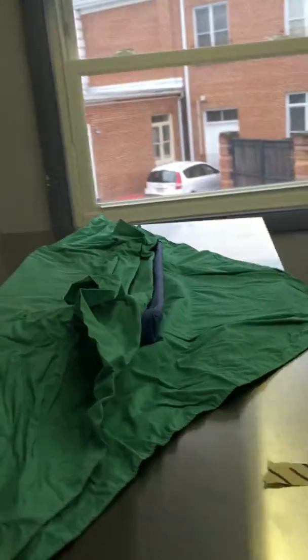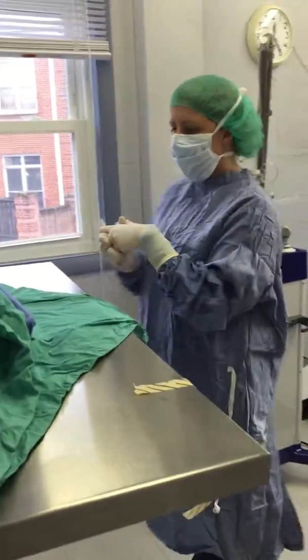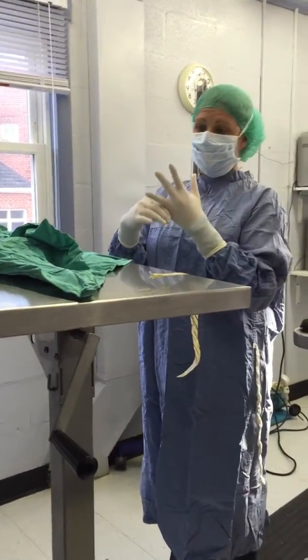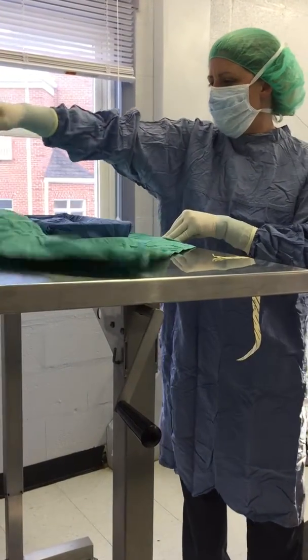The pack was last autoclaved on 4-1-15 by MP, who's one of our lovely assistants. So what I'm going to do is finish opening and set up the sterile field so our surgeon can come in and do the surgery. I'm going to pull the last flap away from me.